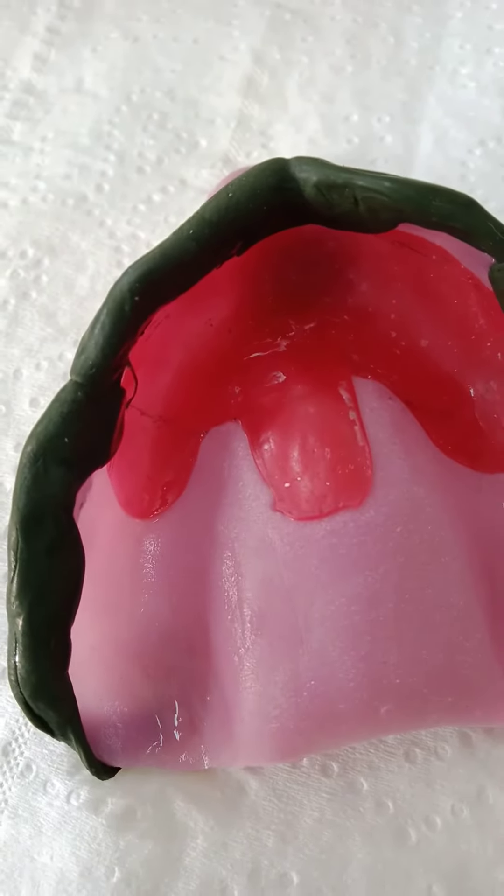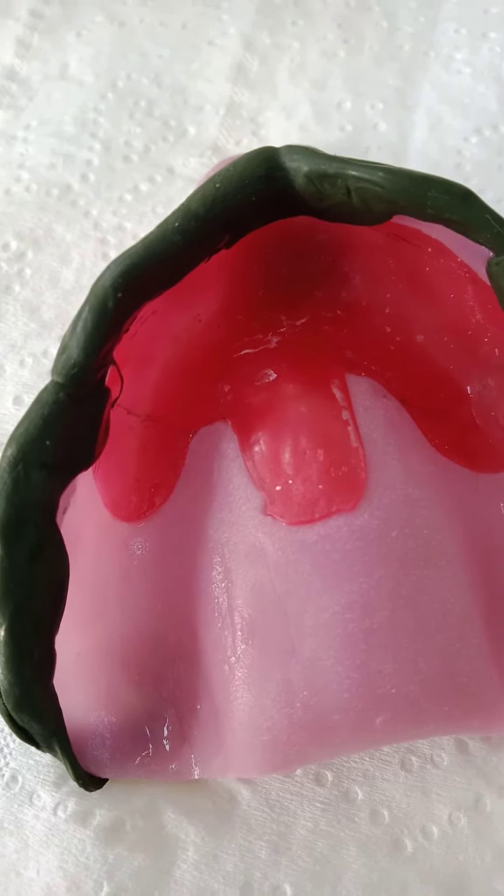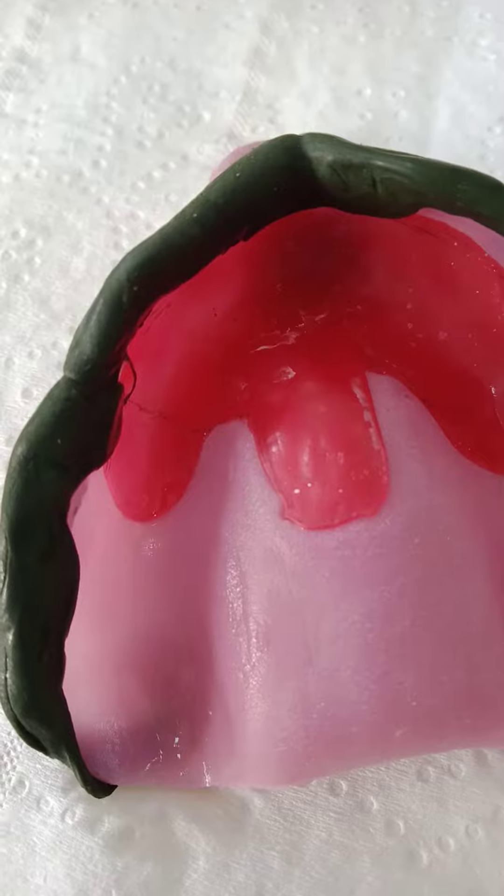How do I remove it? I heat up a lacron carver, I cut it, and I leave an overlap lingually. Two or three millimeters are enough for the green stick to stick to the tray. More than that, it's intruding on the fitting surface.